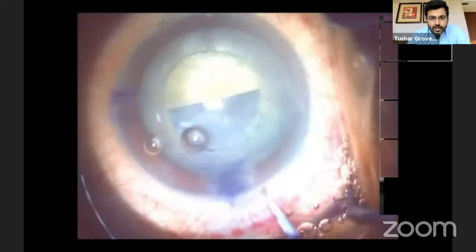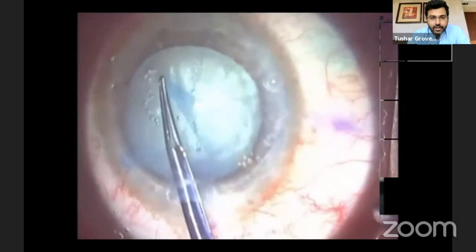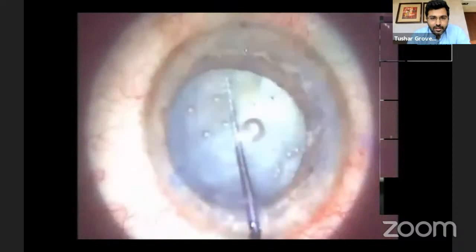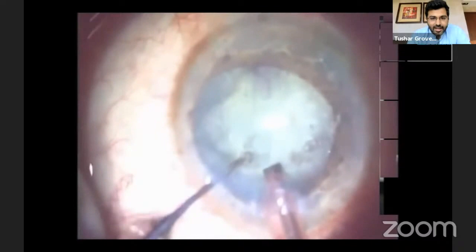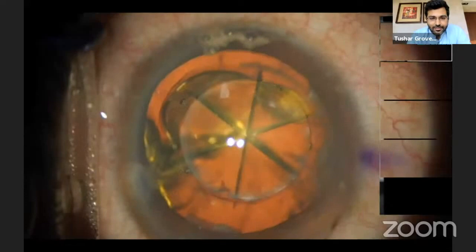That's why it's important to stain white mature cataract cases even in femtocapsulotomy, because sometimes you have what looks like a complete rhexis, but if you look carefully there is an uncut area. In cases where we had about six clock hours of uncut capsulotomy, we did manage to get a manual capsulorhexis, but as soon as we went in and did the nuclear segmentation, we realized the anterior capsule had gone posteriorly and there was a large posterior capsular tear with drop of contents.